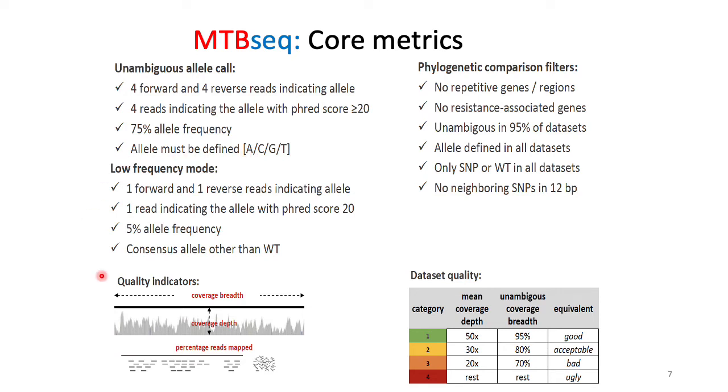So this is a very good detection mode. For example, consider that we have a patient under treatment with a bedaquiline-containing regimen, and you get culture positives at different time points, for example, at month 3 and month 6 of the treatment, and you want to see if you have any subpopulations that became resistant to bedaquiline or other drugs.